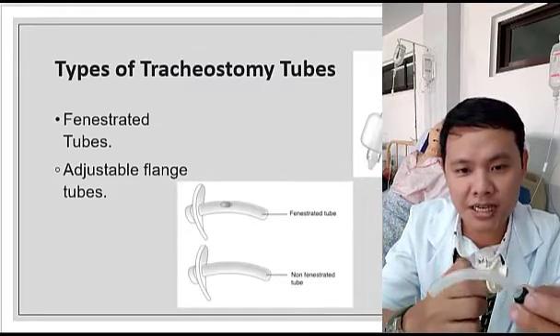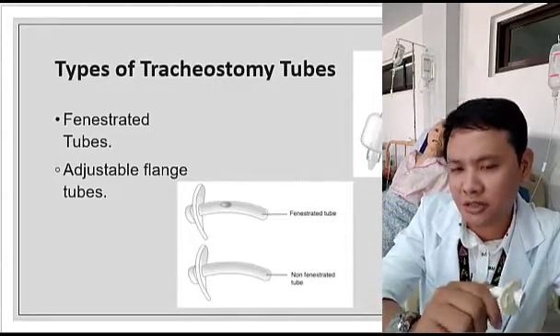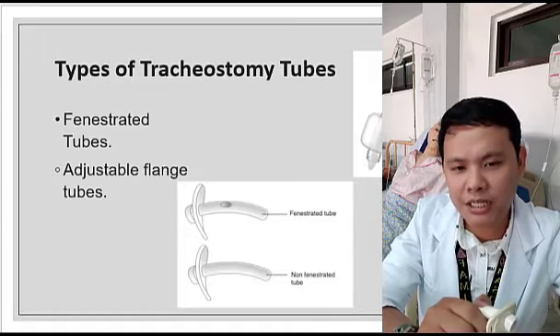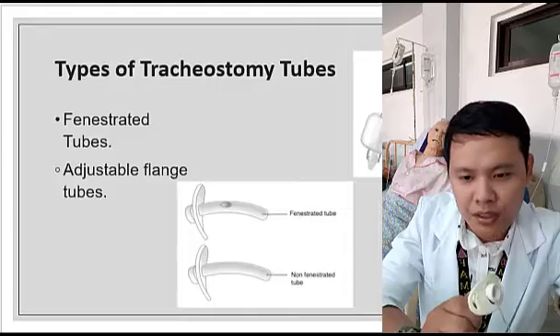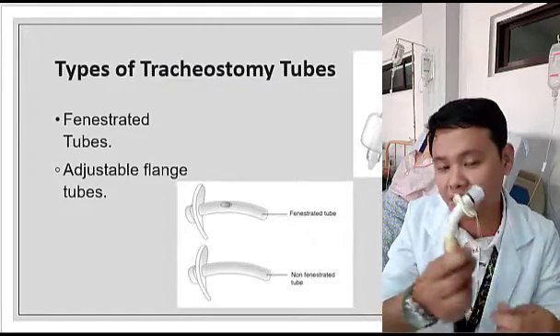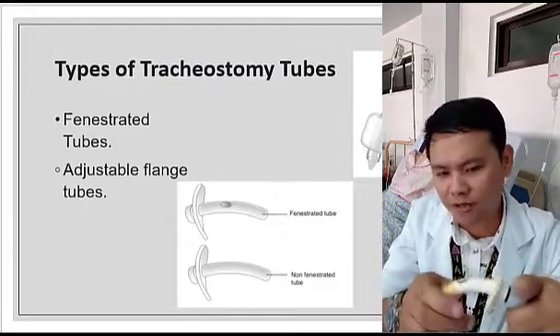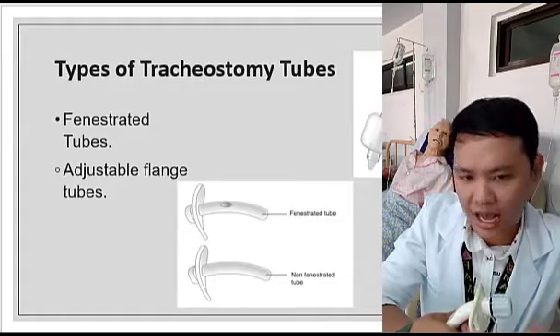Okay? Kapag ang pasyente natin, po pwede na or nakikita na ni doc na, uy, baka pwede nang tanggalin yung tracheostomy na to. So, before that, kailangan pag-practicein muna natin yung client natin na huminga using the nose and mouth. Okay? Hindi kasi pwedeng basta mo na lang tatanggalin. Hindi pwedeng tatanggalin na lang kaagad ni doc yung tracheostomy. Okay? Pero kung ang client natin, it's really hard for him na makahinga or breathe in and out sa may nose.